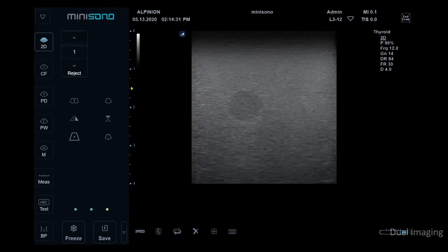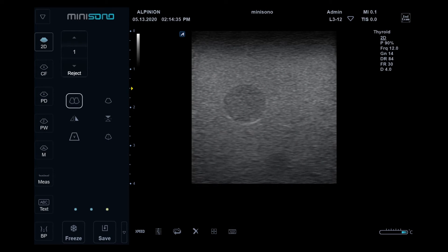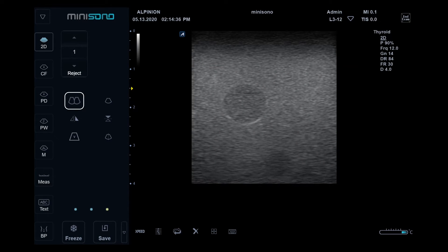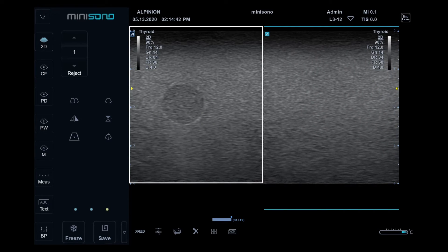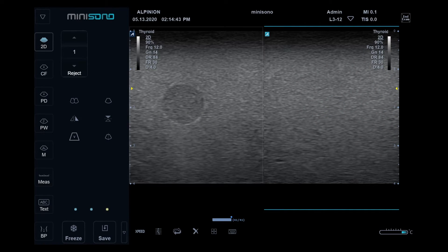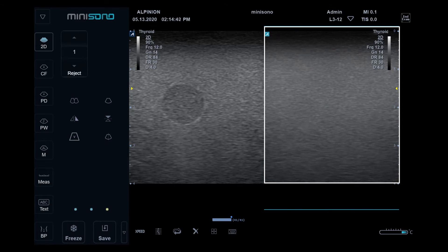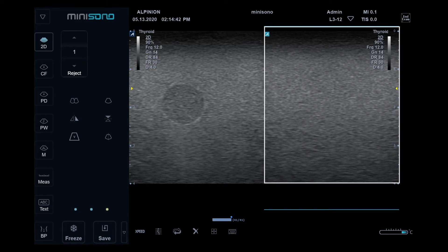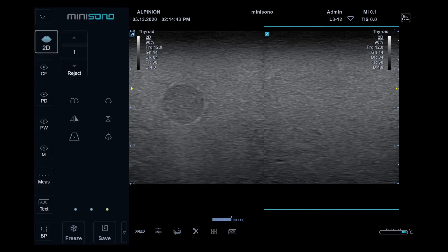Dual imaging: to use dual imaging, tap the dual image icon. The image is shown on the left of the display. Tap the dual image icon again to activate the second image. Tap 2D to exit dual imaging.